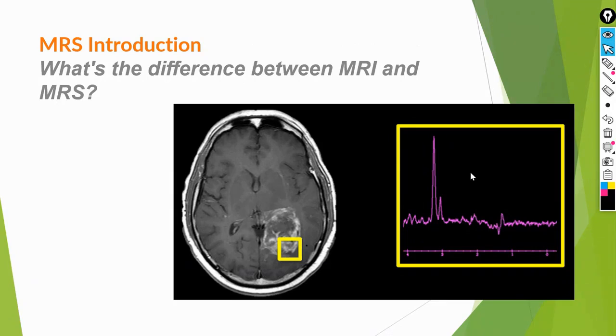I was just talking a little while ago and mentioned that all the atoms I have give me precession frequency. I can say that all the atoms in the world, guys, contain protons. The proton is present in the nucleus, and this nucleus exists in every atom in the world. So, any compound or any atom you can imagine in the world must contain some protons. It must have a proton, okay?